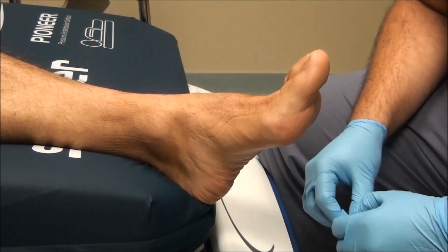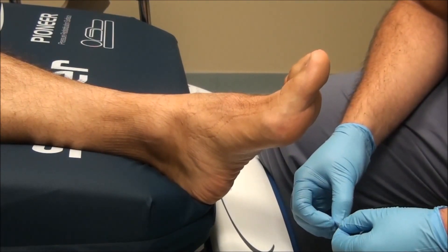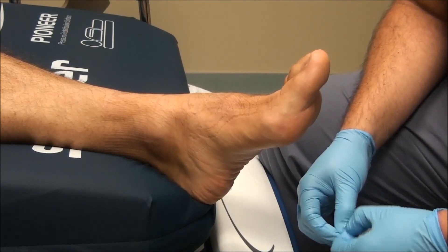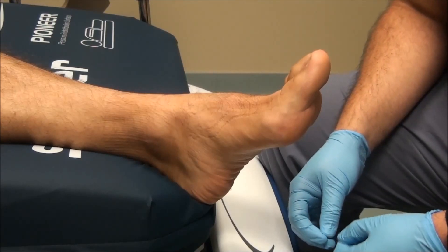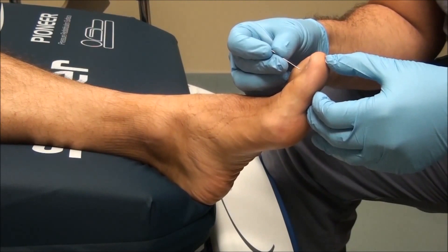The test is performed initially either on the patient's arm or hand so that they can understand the sensation of what the pinprick feels like. Once they get that sensation understood, you have them close their eyes and then perform the test. A positive test is one in which the patient does not feel the sensation of the pinprick.